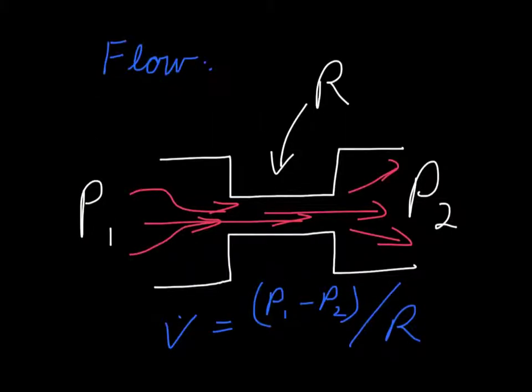So on this slide, you can see I've got the equation here for flow, and it's the pressure gradient over resistance. All right, so I've rearranged our resistance equation to show how we can tease out flow, and this is just a short form for flow. All right, so we need a pressure gradient to establish flow, and we need it across a resistance. All right, because if there was no resistance, as soon as there was a pressure gradient across here, the molecules would just go into equilibrium. So P1 would equal P2, and there would be no flow. So we need a pressure gradient to have flow across a resistance. That's the key element of this diagram here.